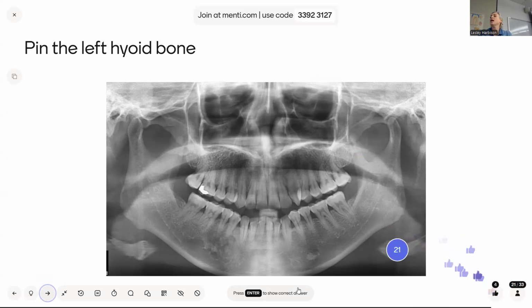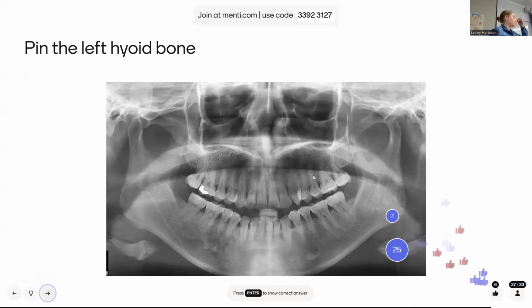So if I asked you guys where the palatoglossal airspace is, where would you say? Can you see it on this x-ray? Right through here, right? So that's the top of the tongue. It's between the tongue and the palate, even though their palate's distorted because their chin was up or down. And then as we come down, where do you see any other air spaces on here?